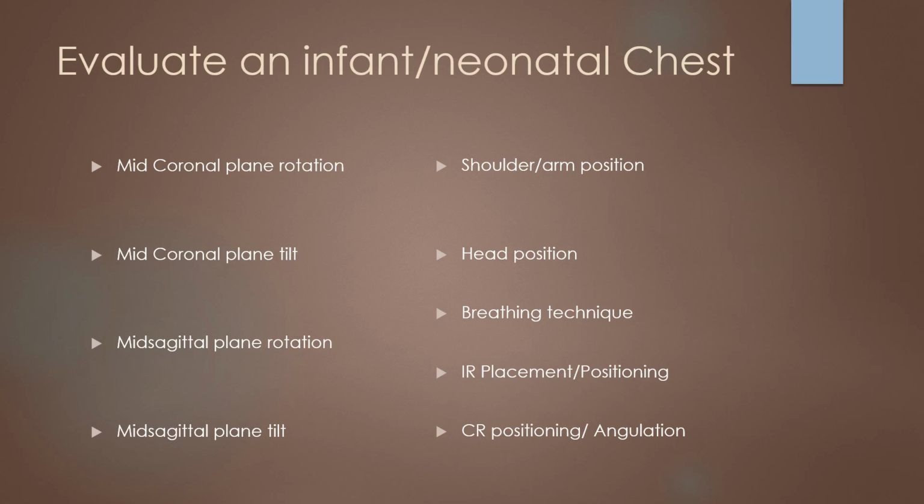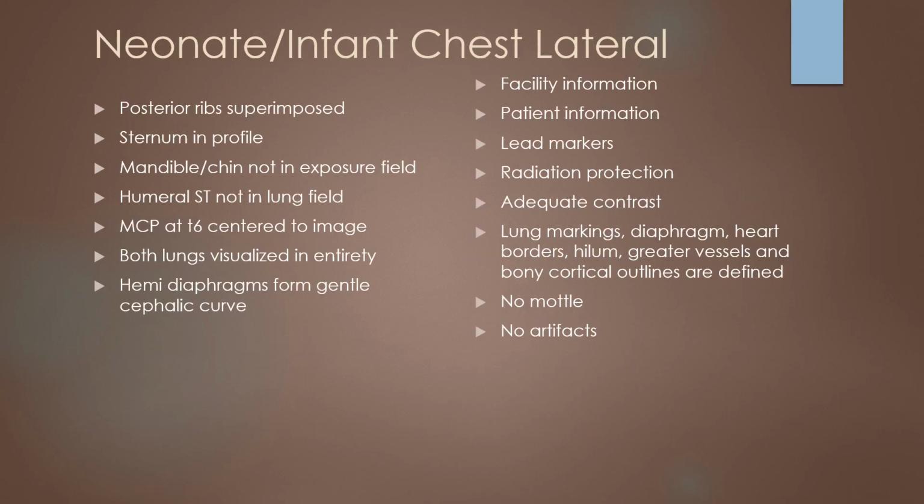So if we look at this, what were we expecting to see? Well, if we have a mid-coronal plane, actually, I'm going to have you guys run through this quickly, and then we'll go over what the book says.